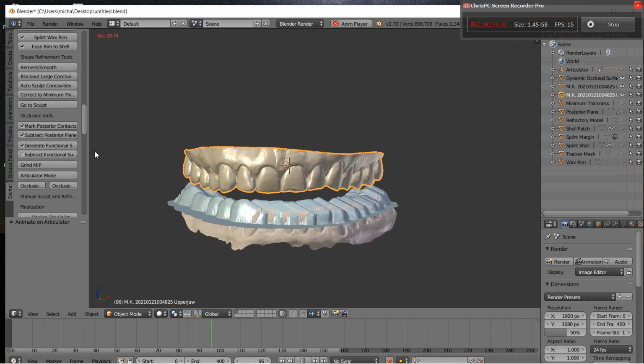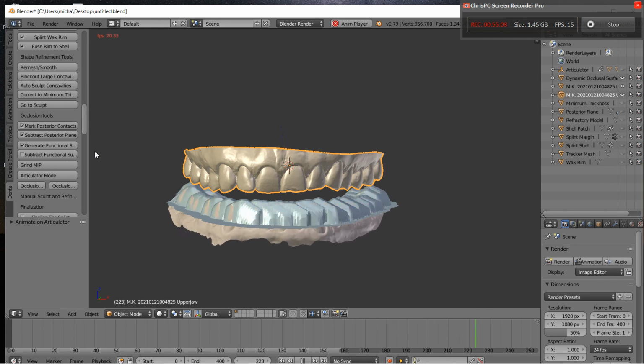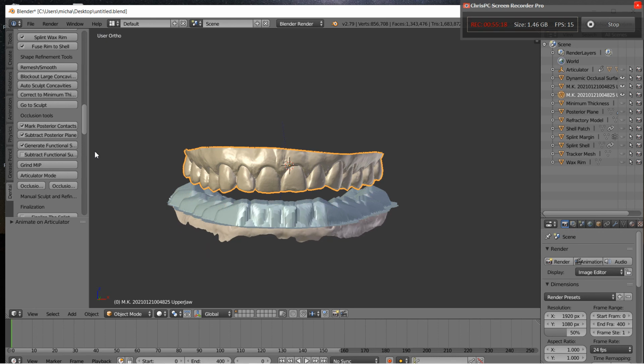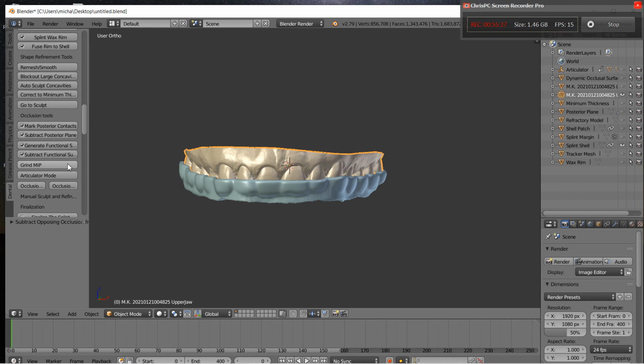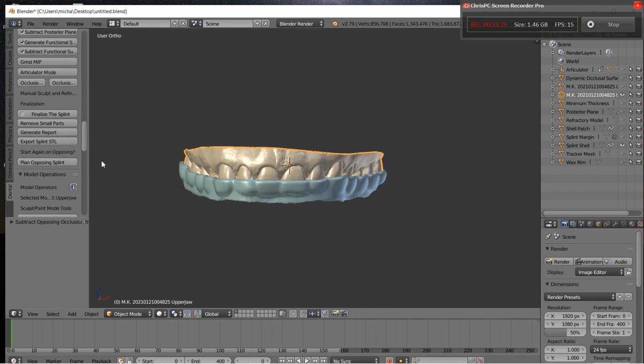So now here, before I could even take an impression back to the laboratory, and probably before I would even have both arches of my polyvinyl siloxane even set, I've already got this mounted on the semi-adjustable articulator. I've already made my hard acrylic outline, and now I'm going through and doing all of the fine adjustments on the articulator. Now from here, we have everything that we need.